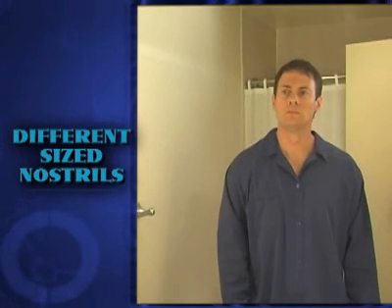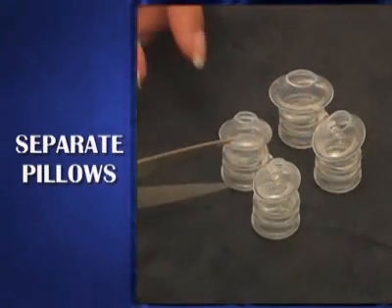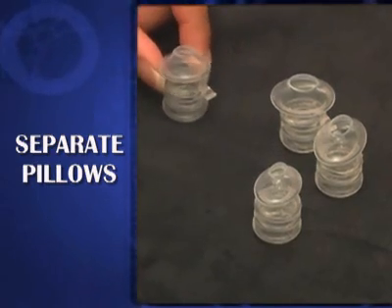In order to accommodate patients with different sizes between the left and right nostril, the nasal pillow sets may be separated. To separate a nasal pillow set, cut the adjoining silicone bar in the middle.